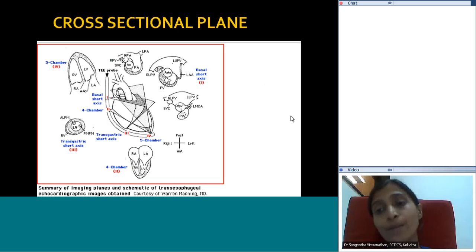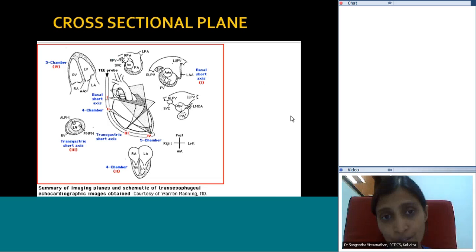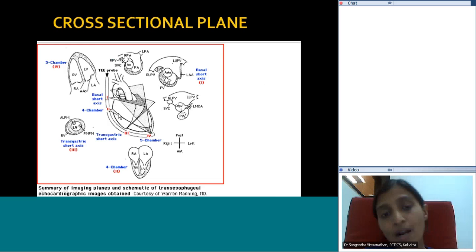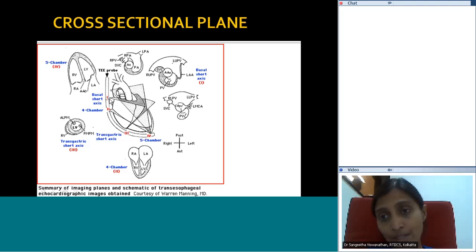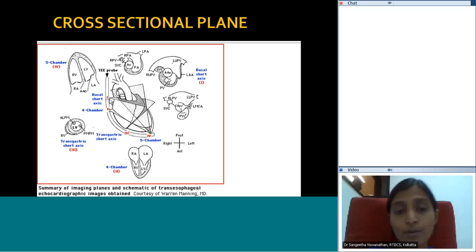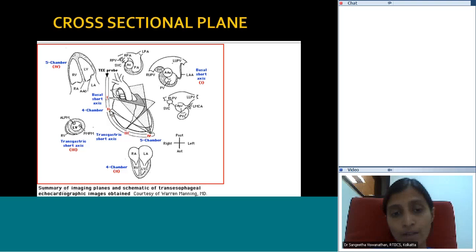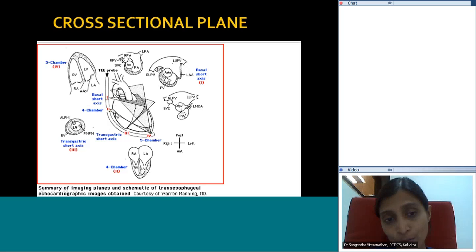Now we look at a diagrammatic view of the transducer plane cuts at various levels and imaging degrees. At zero degrees at the mid-esophageal level — the mid-esophageal four-chamber view — the apex of the sector shows the atria and the base shows the ventricles, giving a four-chamber image.